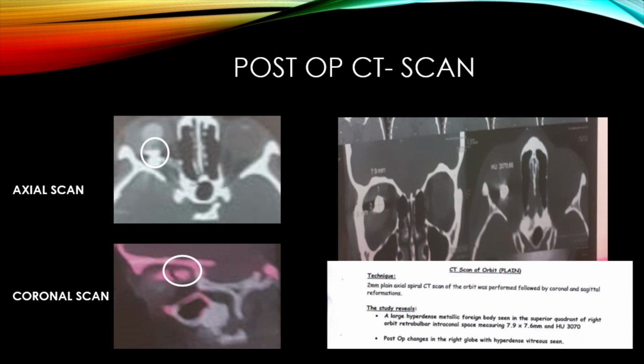You also said something about a case being taken up on a suspicion of foreign body and then the foreign body not being there. I think if an ultrasound doesn't show a foreign body, but you still strongly suspect, maybe it's a good idea to have a CT scan first. Because if it's still not showing up on a CT or is in the retrobulbar space, the indication for a vitrectomy in an already compromised anterior segment view may not be there. You can defer that intervention to a later stage when the eye is much quieter.